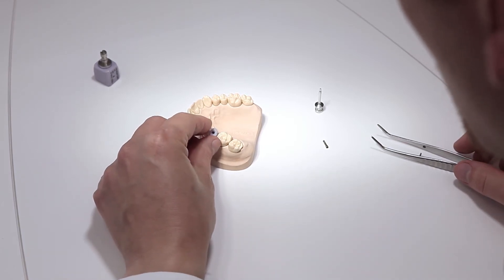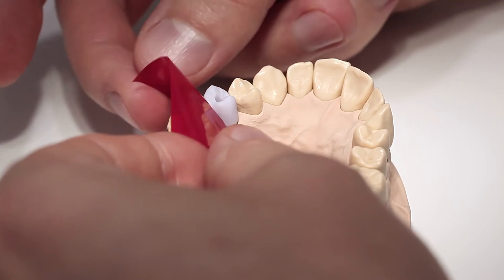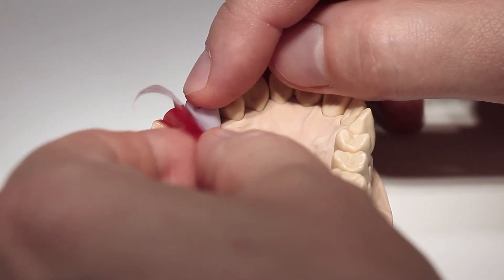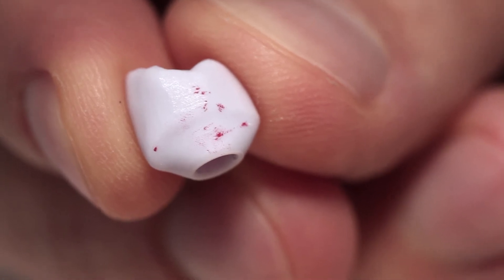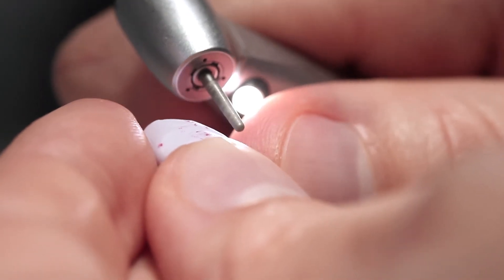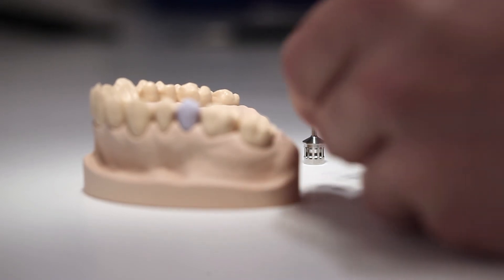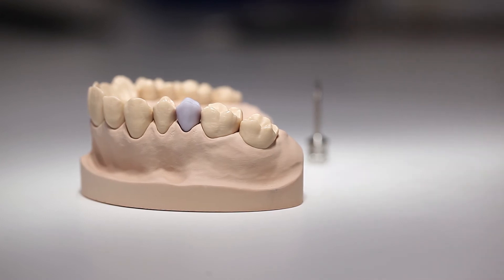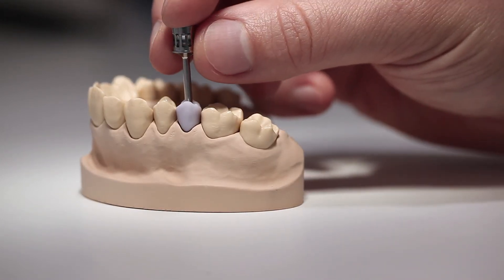Place the temporarily secured hybrid abutment crown on the implant. Do not perform any functional occlusal checks at this stage. Check the proximal contacts and, if necessary, adjust them using suitable grinding instruments. Manually screw in the dedicated implant screw. Check the geometry and fit of the hybrid abutment crown in relation to the gingival margin.